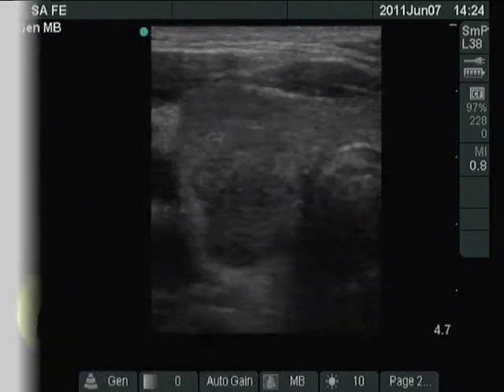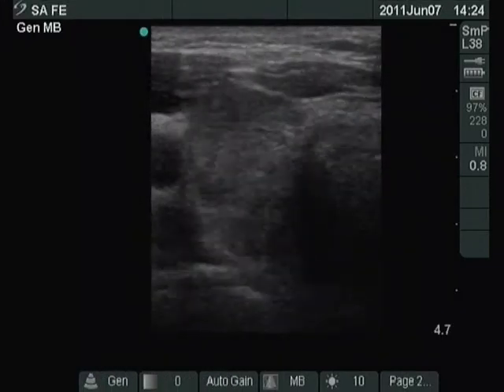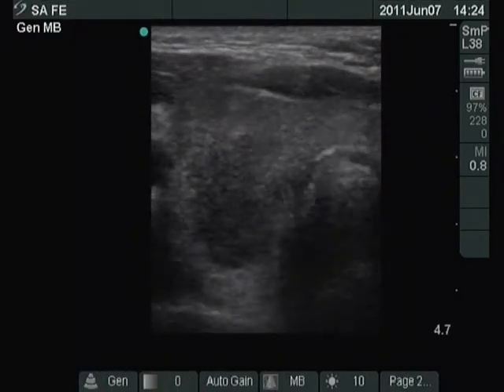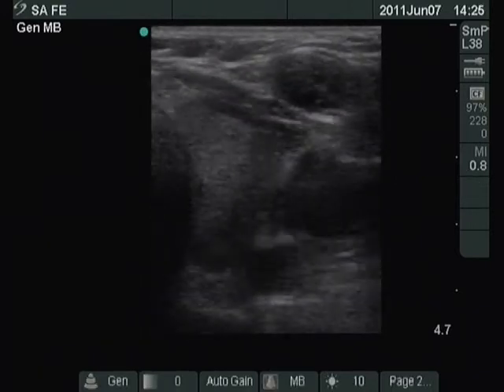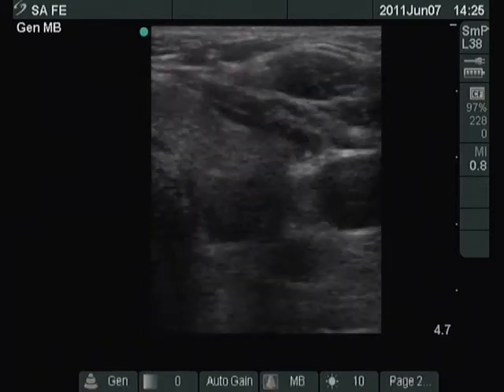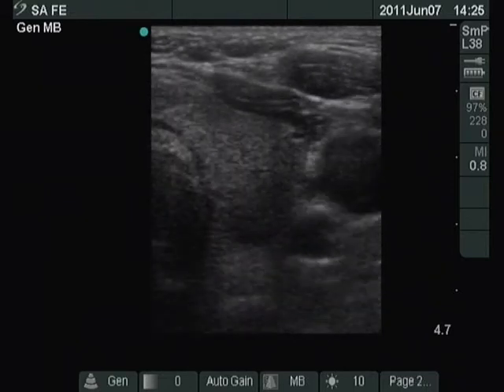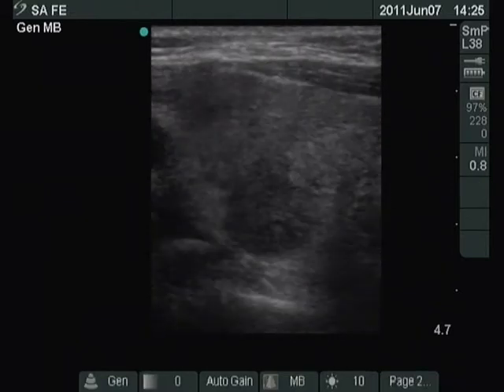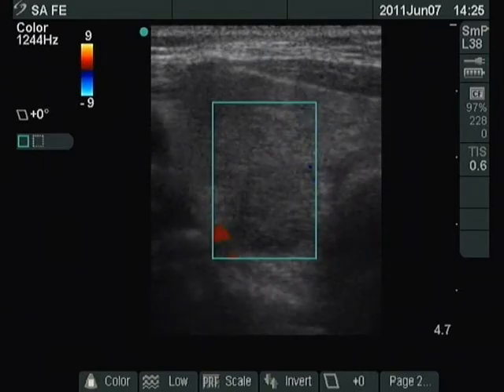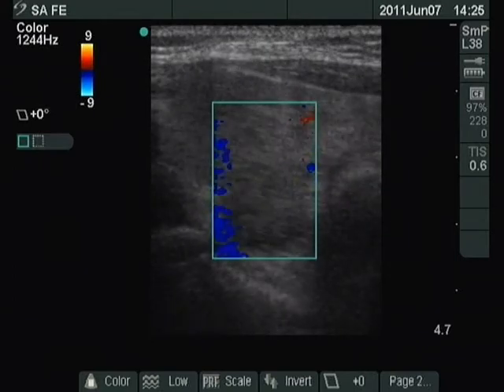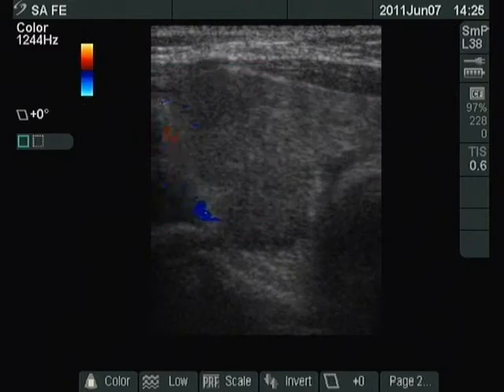A patient is demonstrated with typical complaints of subacute thyroiditis. There is a hypoechoic lesion in the dorsal part of the right thyroid. The presentation is similar in the left lobe, but here we can find more hypoechoic areas with decreased or absent vascularization. The borders of the hypoechoic lesions are ill-defined.